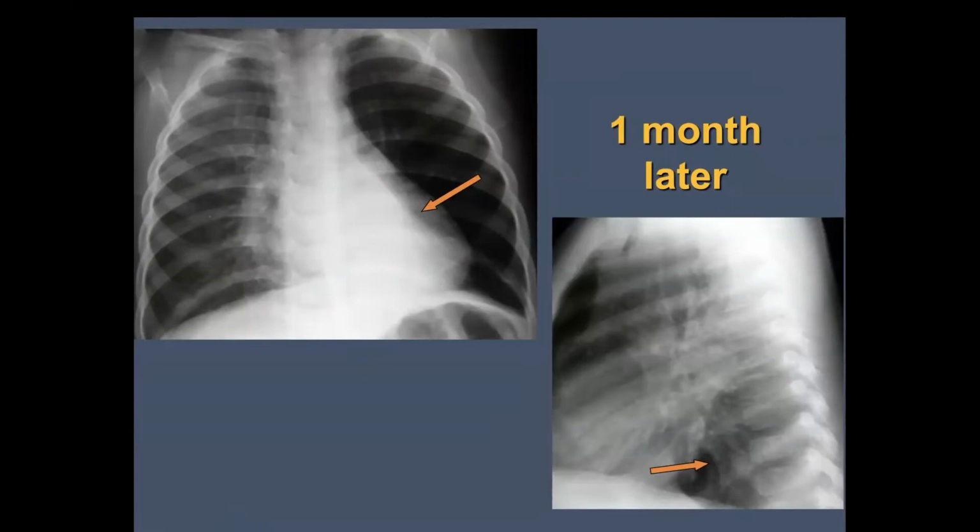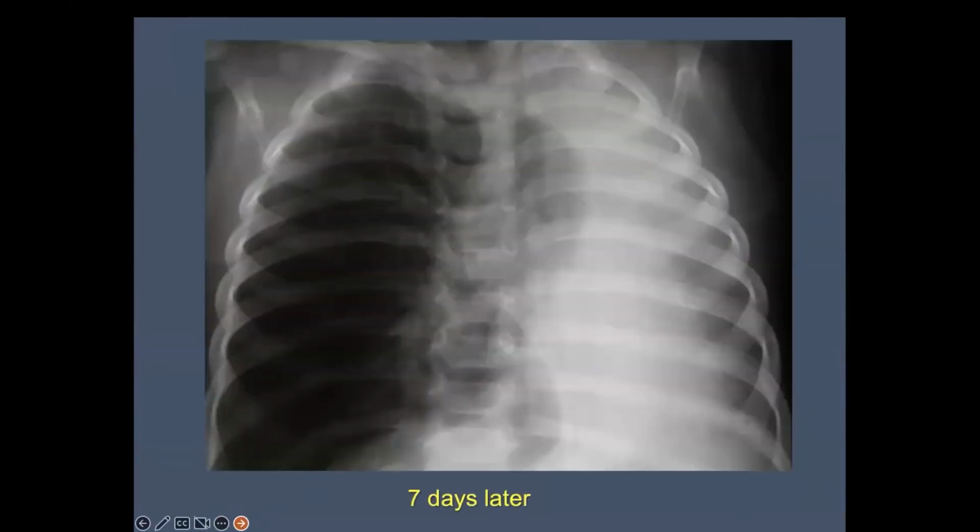So this was atelectasis that developed somewhat distant to when the diagnosis of TB was initially made. And this went on to be progressive and to completely collapse that left lung a week later. So these are complications that do not occur immediately necessarily, but can occur well down the line after the initial infection.